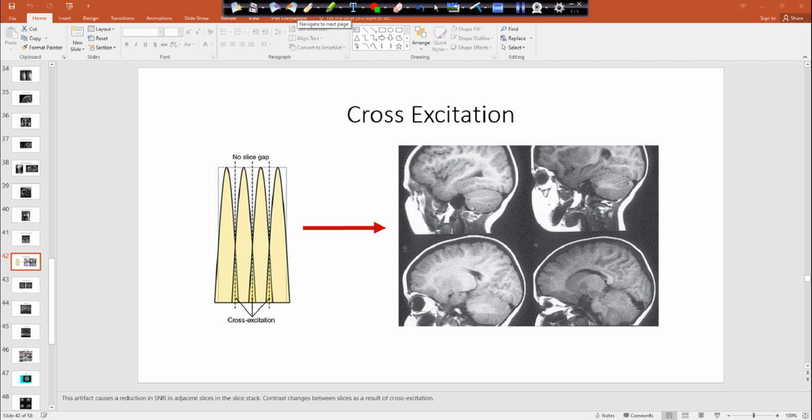Lily, you got a question? Yeah, so how do you do the concatenation? On the Siemens scanner, you can actually increase your concatenation. It's just you go from 1 to 2. There's a little box on the bottom, I think the bottom right. Yep.